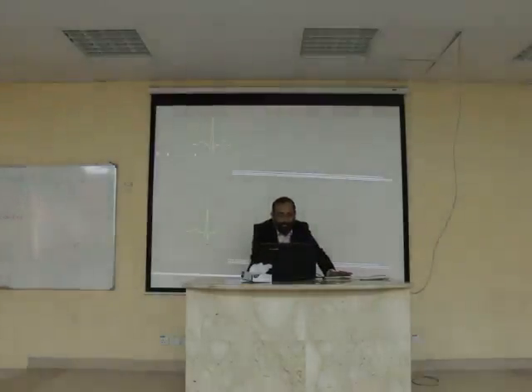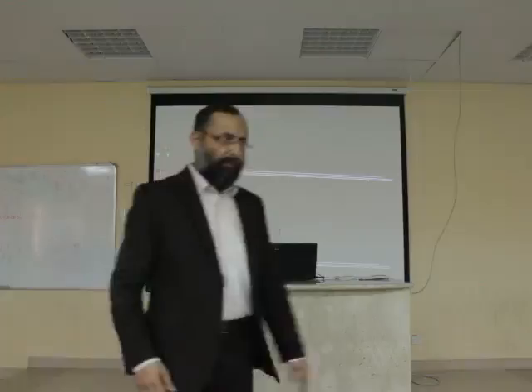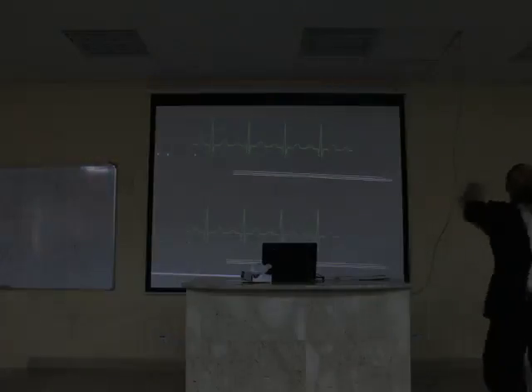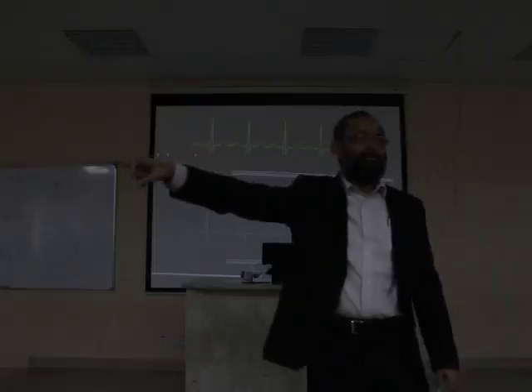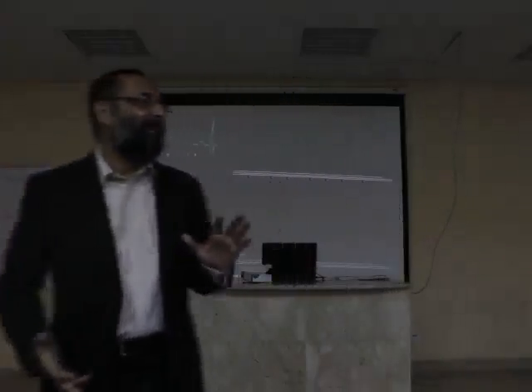Okay. All right. This is the live running strip that you see on the monitor in hospitals or in the wards or in the movies or pictures. You have seen it. ECG is running like that, isn't it? Yes. And you see different fluctuations are there. It's not a straight line. When a straight line comes, what does it mean? It's the death of the person, or death of the heart at least, or arrest of the heart, if not death. Okay? It's arrest of the heart.